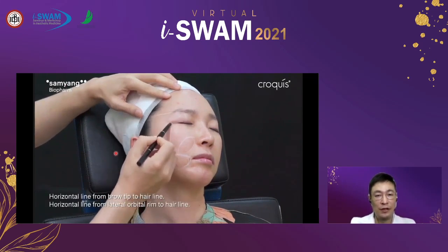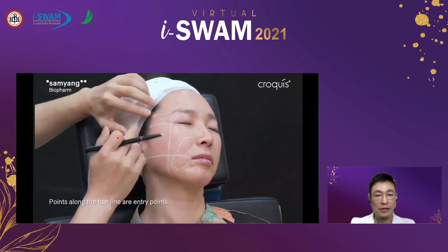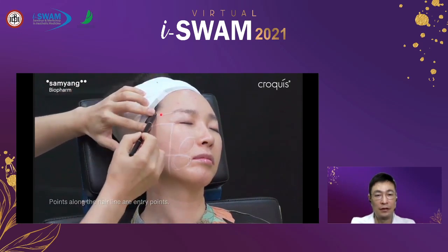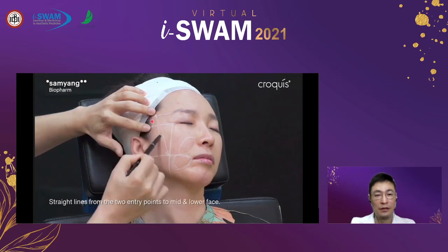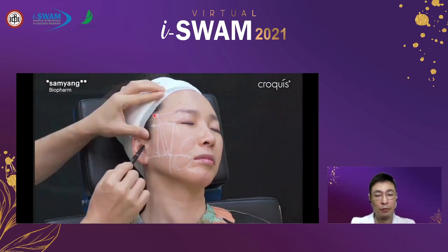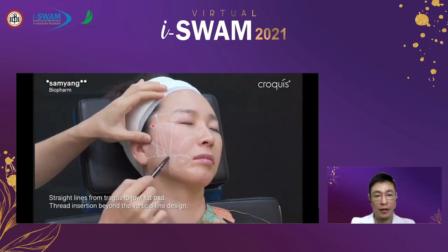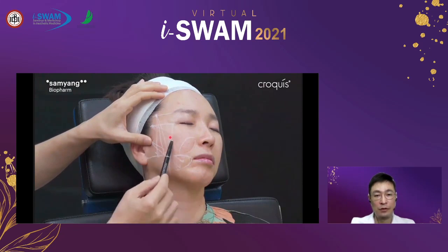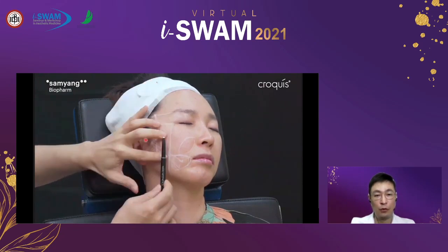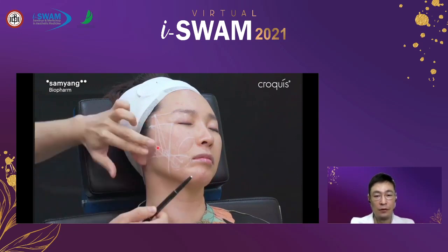Usually the entry points are made by these two lines crossing the hairline. The upper entry point will be used for lifting the lower face, and the lower one will be used for the mid-face lifting. And one more entry point, just in front of the tragus, for the jowl lifting.